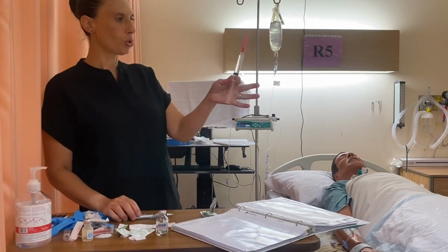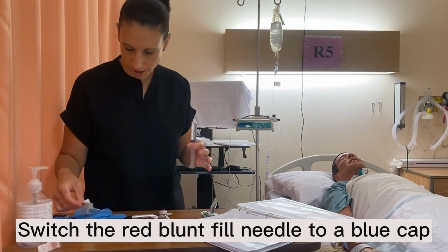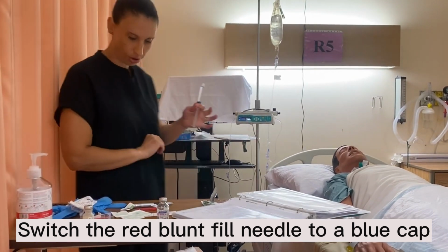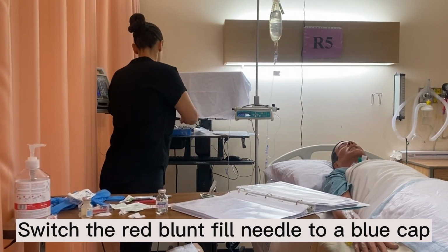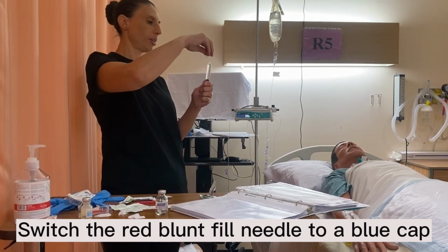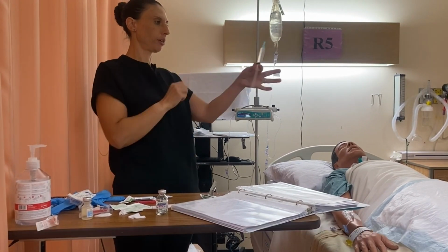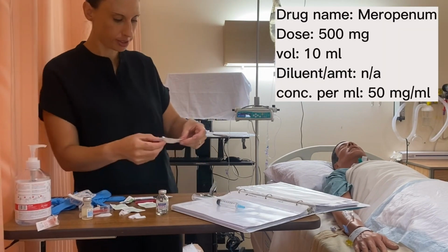And then also too, we don't wanna go to the bedside with this blunt fill needle. So we're gonna take it off and we're gonna put on a blue cap. Okay, so taken from the package, we're gonna sterilely put on a blue cap. Make sure we get all those air bubbles out there. There we go. Okay, now we can label this medication as well.